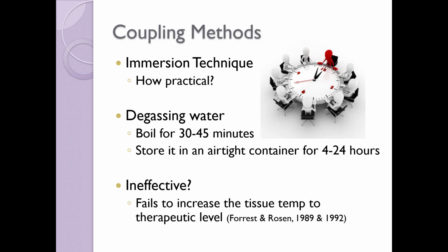As a coupling technique, the immersion technique is not often utilized because of several issues. First, practicality. It is difficult to set up the proper parameters, such as finding a ceramic or metal object in which to submerge the patient. Second, degassing the water. Boiling the water for 30 to 45 minutes and then storing it in an airtight container for 4 to 24 hours takes a lot of planning and time on the clinician's part.